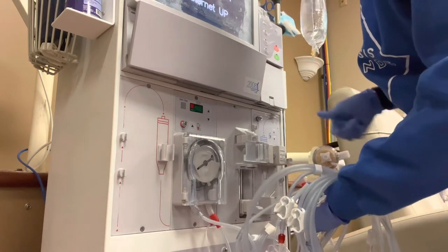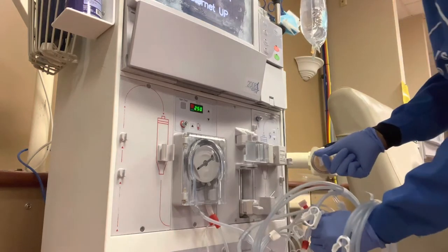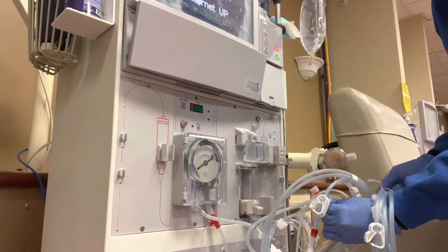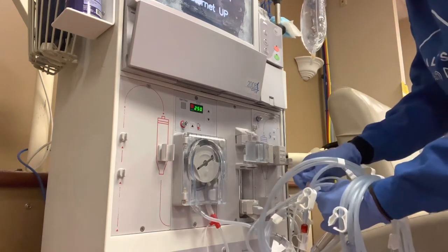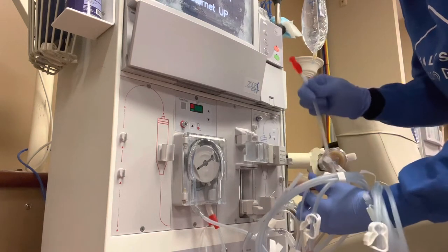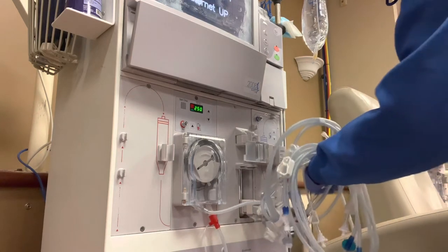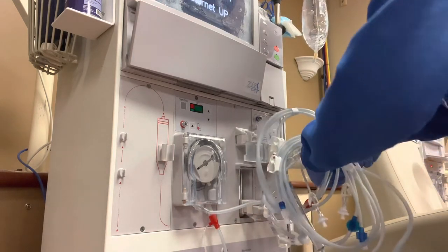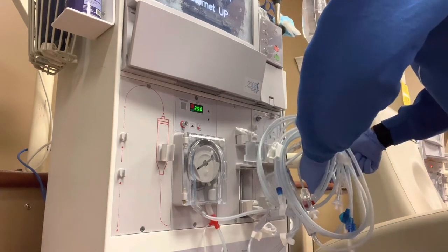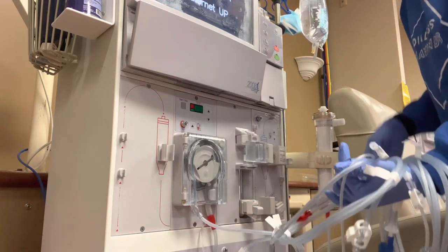Trying to remember, did I clamp this, did I clamp that? Like, no, practice clamping as you go so that you don't miss a clamp, so that your transducer isn't wedged. Sometimes you can have faulty lines, so that can cause your transducer to get wet. It's possible to still miss a clamp regardless, but practice clamping as you go.